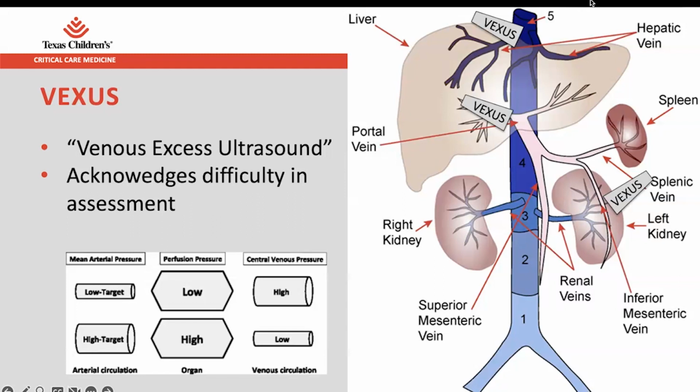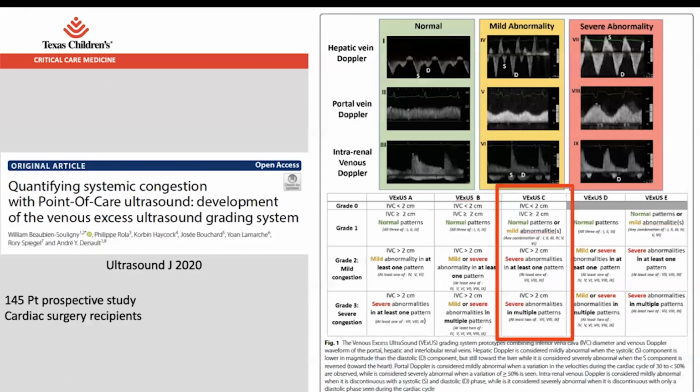How well is venous flow coming out of the mesentery, and how easily does it flow through the liver? How congested is the liver? And also looking at the kidneys, and looking at the venous return there as well, thinking that ongoing kidney injury and congestion could contribute to impedance in vascular and venous return.